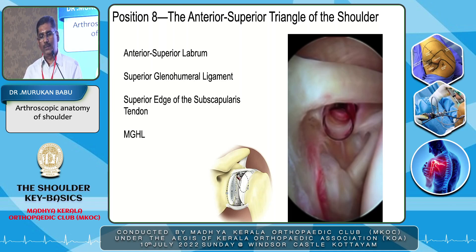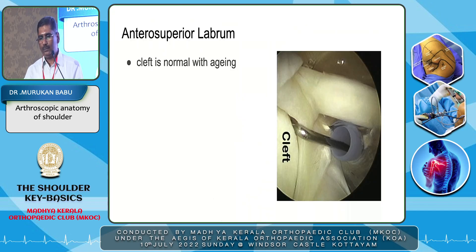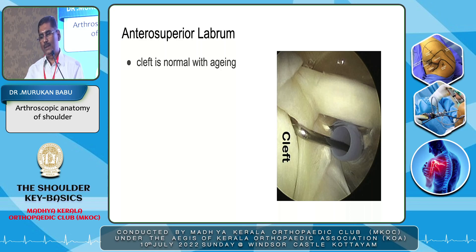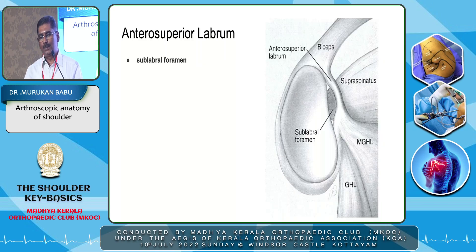The anterior superior labrum — with aging, you can confuse it with pathological changes. The cleft is normal with aging; probe that area to see any pathological changes. Sometimes the labrum is detached in the superior part showing a sublabral foramen — that is also normal.